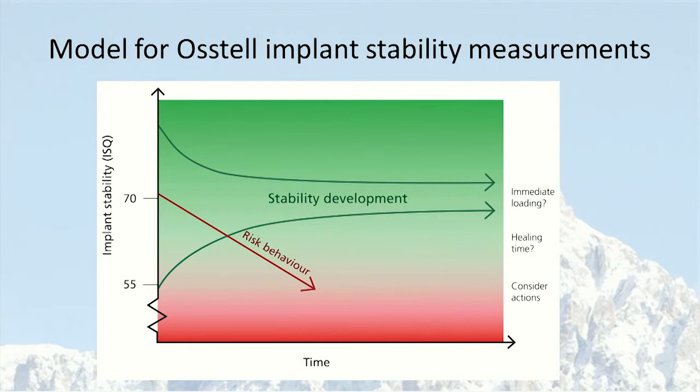And of course, inside this diagram, if we have implants going like that, that is a risk behavior, and then we have to cope with that, and I think Dr. van den Bogaerde will discuss that.